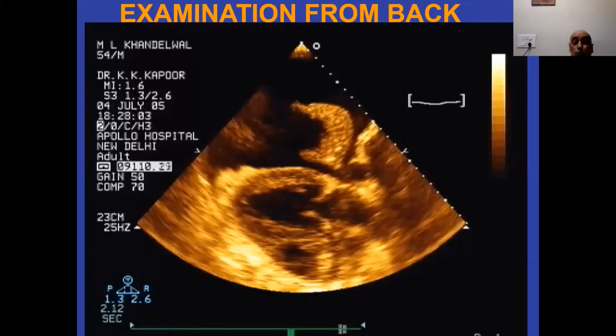Sometimes there is a problem from the transthoracic view, whether this is a loculated pericardial effusion or actually a pleural effusion. It can be very problematic at times. Therefore, this view from the back will resolve all the problems. So this is very important.